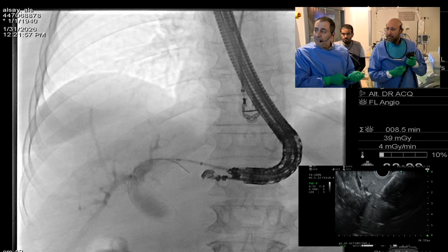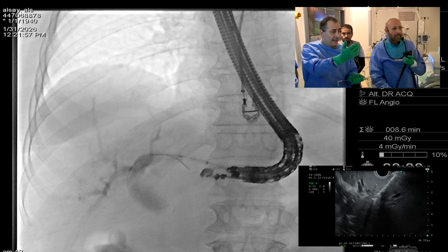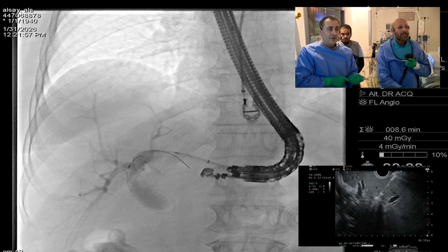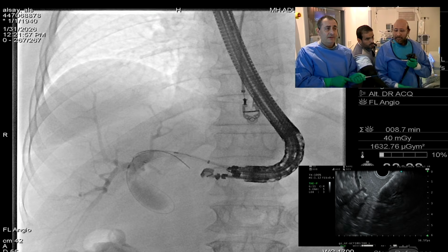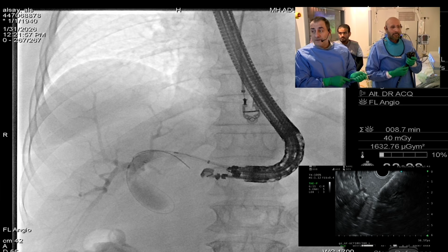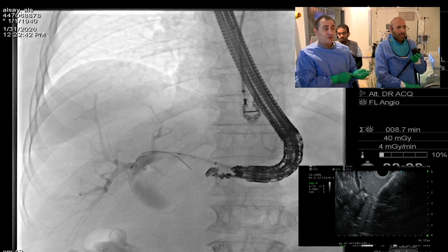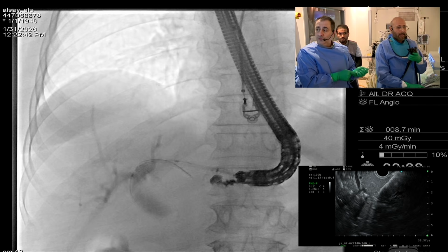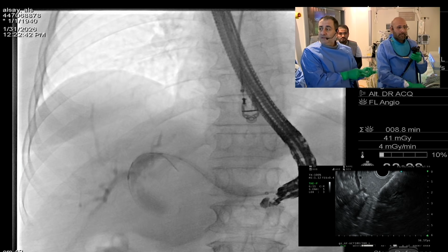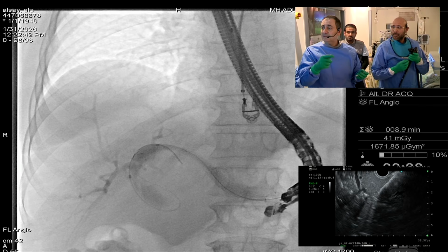Ok. Maintenant, il faut que tu t'écartes de l'estomac. Can we shift to endo, please? How do you decide about the size of the stent? Yeah, that's a very good question. The size of the stent is obviously based on the biliary tree. That's why we want to make sure that il faut que tu t'écartes un peu, et voilà. Attends, pas trop vite, voilà. Ok. Endoscopy, please.